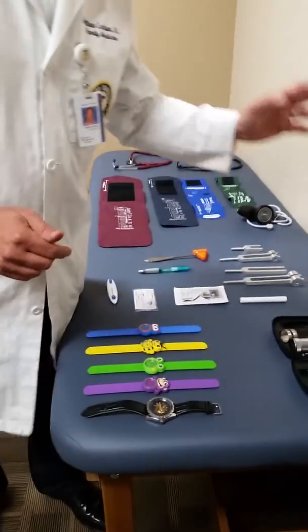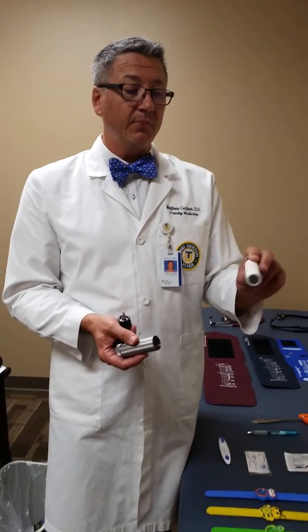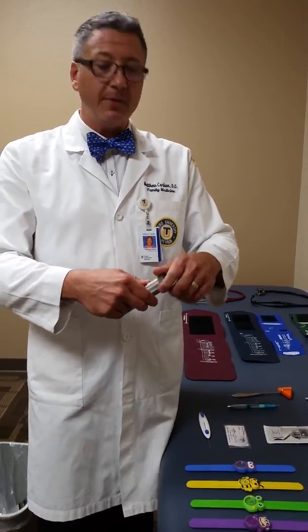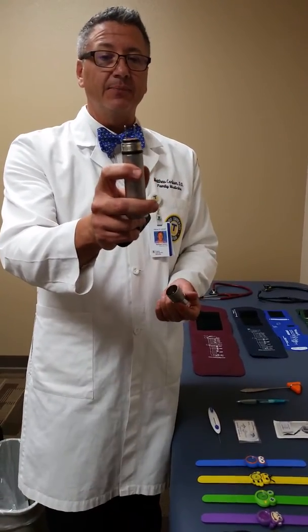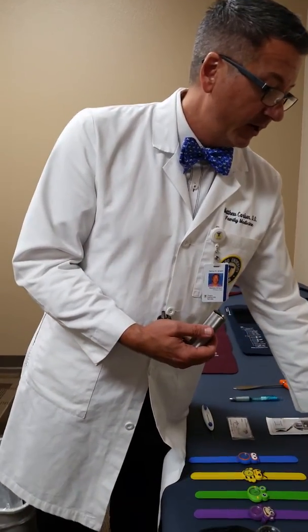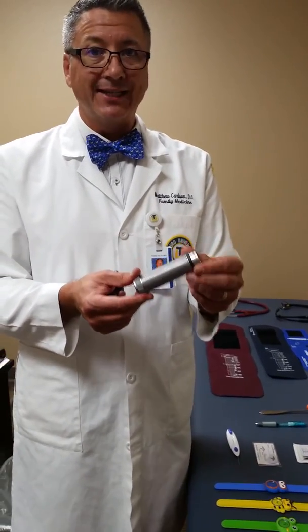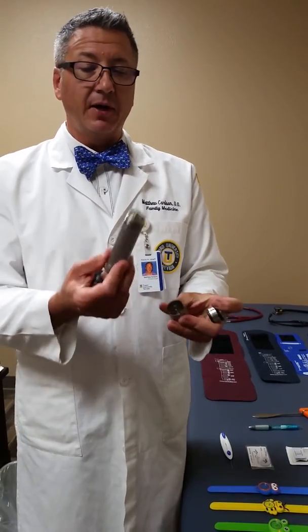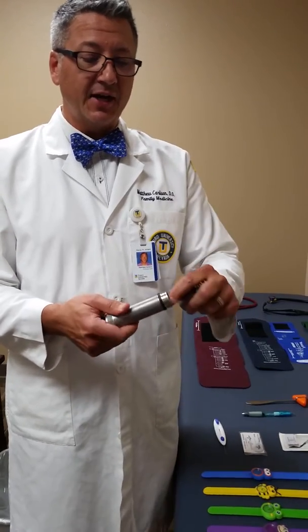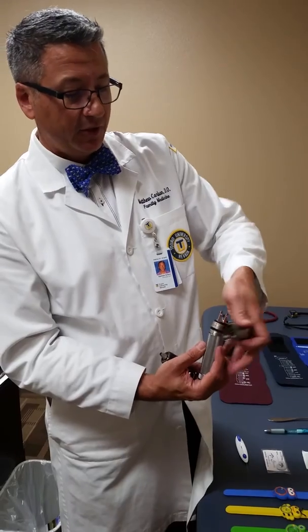Moving along now to our otoscope. This is an otoscope made by Welch Allyn with a nickel-cadmium rechargeable battery. When setting it up, take the top piece off and stick it into the outlet — let it sit for at least 24 hours the first time you charge it. The kit also includes a special ring that allows you to use standard batteries instead, so you can use either the rechargeable or standard battery configuration.